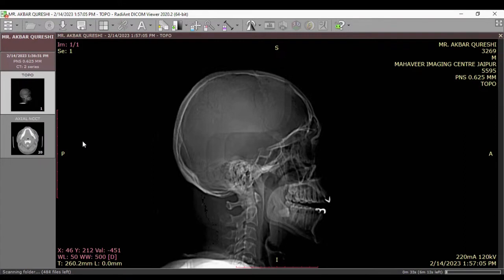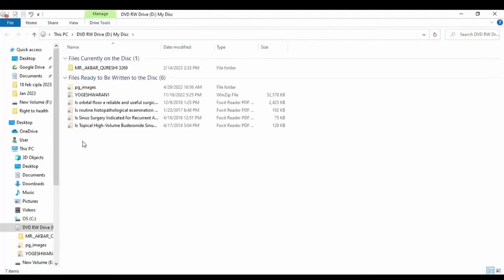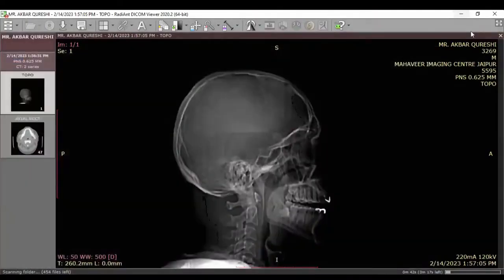And there, hot saline is important in initiating the coagulation cascade. In the sinonasal area, we rarely promote hot saline because it can be detrimental to the mucociliary activity. And it is not required in the sinonasal region. So, hot saline is important in the skull base, not in the sinonasal region.